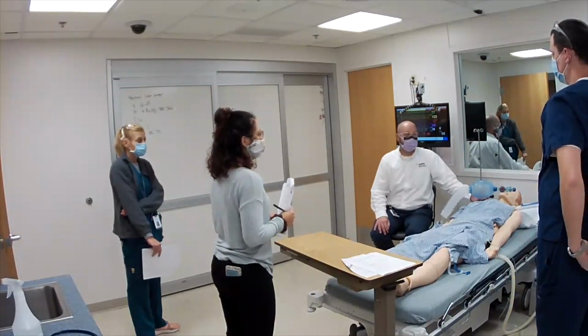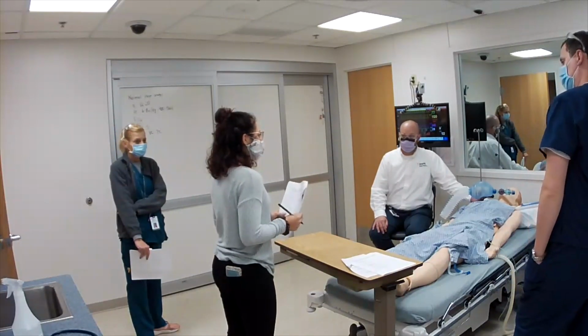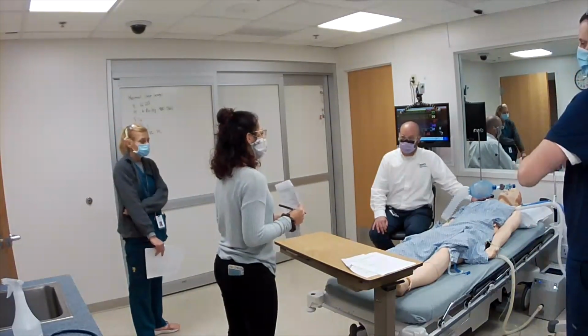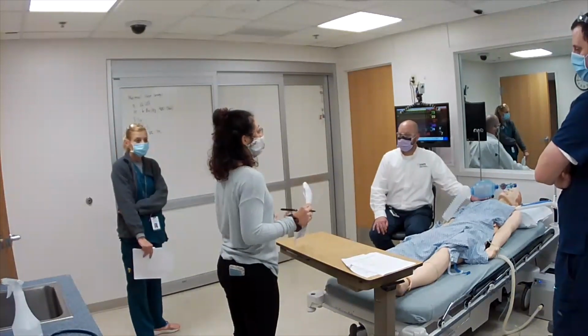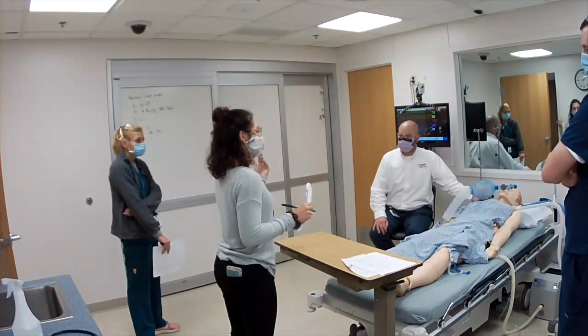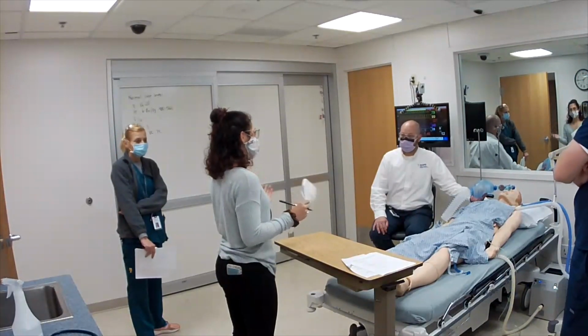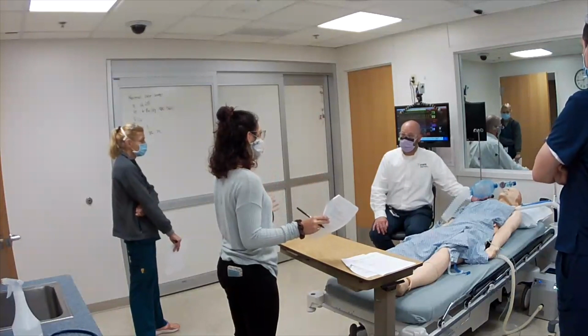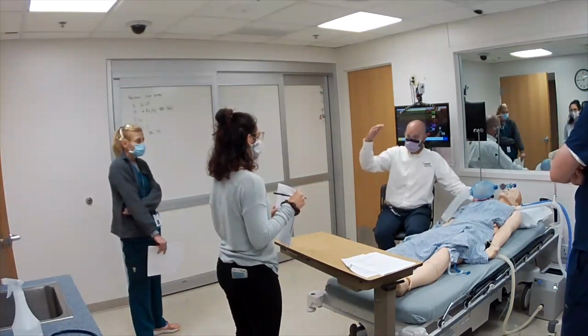Advantages. Patients that you're having issues with their pressures, where the pressure's too high to give them the volume that you need. You have to set the pressure in order to get a better volume. It's easier to manage, so you don't get up into dangerous pressure territory with unhealthy lungs. Yes, right? Then that is a little more protective, right?